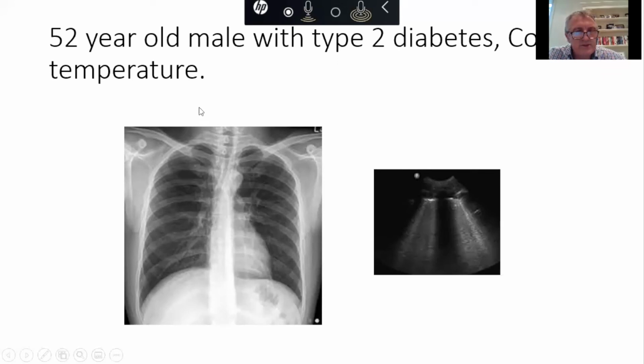You can measure the JVP with ultrasound. You can measure the dilatation of the IVC in patients with heart failure. Also, again, with patients with suspected pulmonary emboli, if the heart is normal, there's no right heart dilatation.